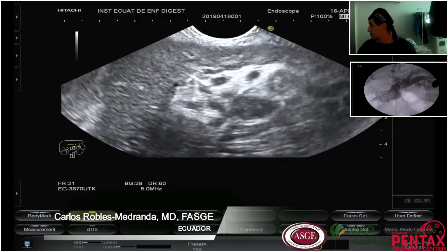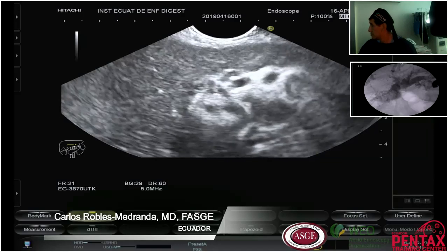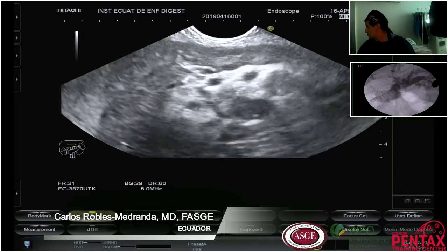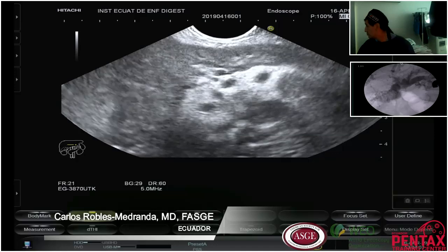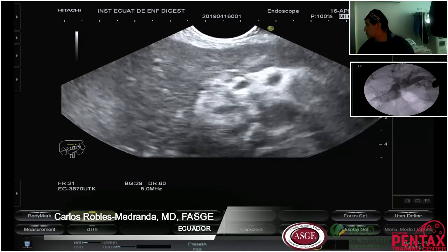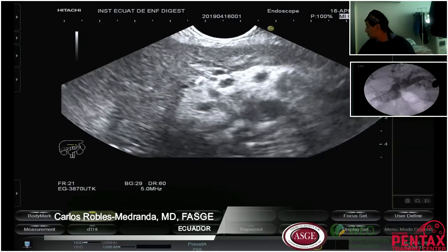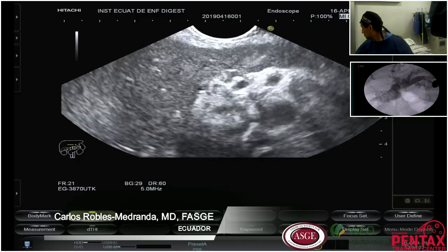Okay. Abre. Abre. Dale. Ok, listo, gracias. Prende la luz. ¿Dónde está la tapa? Vamos.